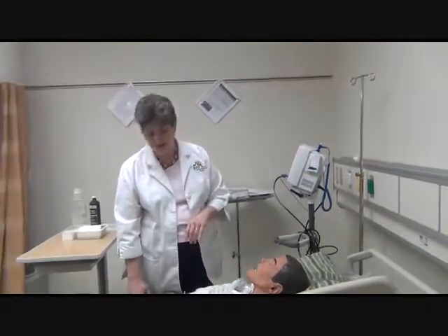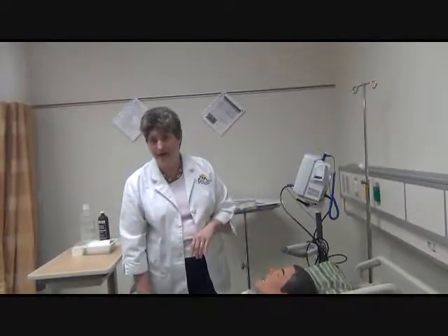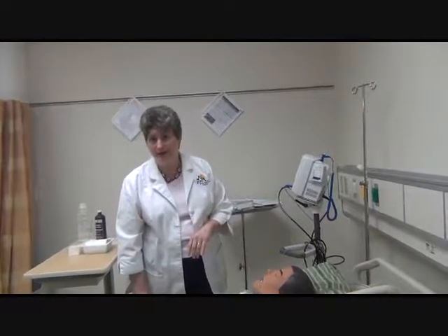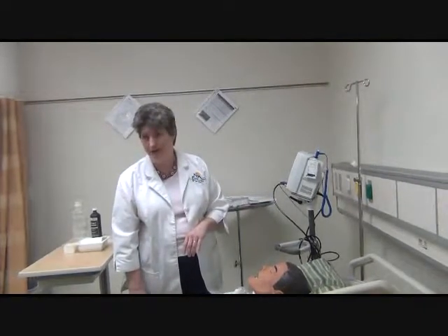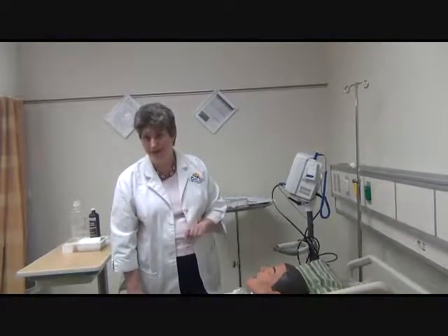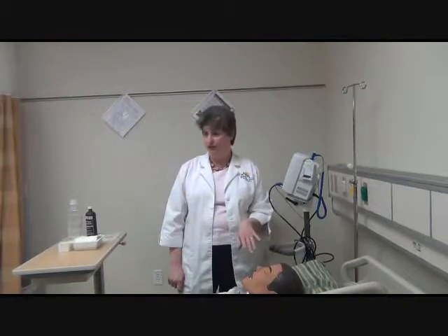You might want that. One of the complications of suctioning and trach care is that you can cause a vagal stimulation and cause the heart rate to drop and the blood pressure to drop. So you kind of want to know where you're standing on that. If your patient is on oxygen, you want to hyperventilate or hyperoxygenate them.